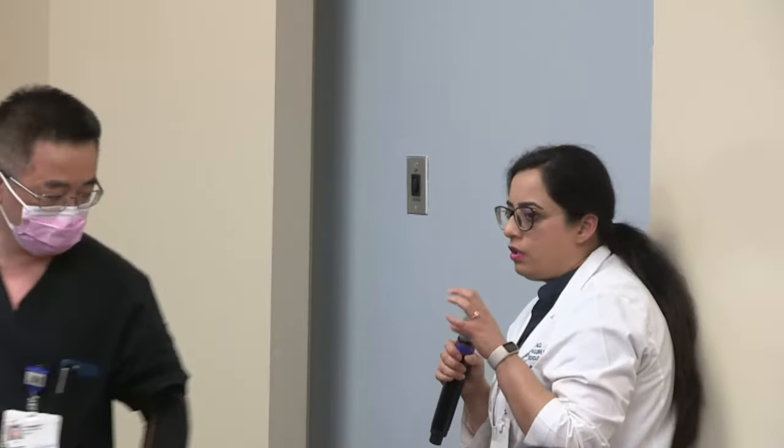So I'll say the actual thrombi that form are inside the LVAD, and now I've been in practice for a couple of years and was a fellow for many years, I've only seen one or two cases which we actually found through CT scan, not echo. So for all practical purposes, it's very rare for you to actually see a clot. Unless it's an aortic root thrombus that you can see when you give contrast imaging, but that too doesn't always present with low flows. So if you're talking about thrombus, echo is not helpful. I wasn't going to say useless, just not helpful.